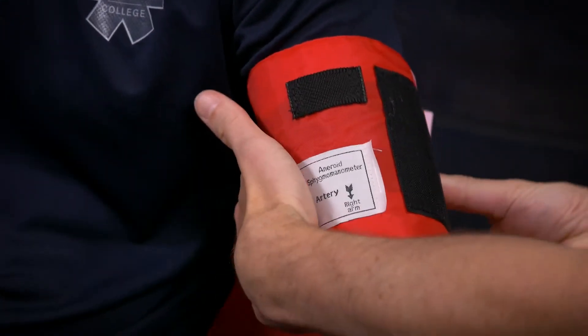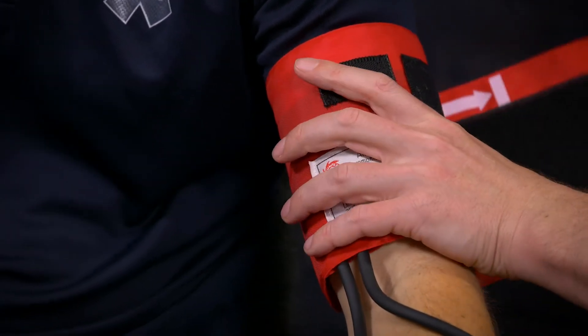So taking a blood pressure now. We'll start by palpation. Ben, do you mind if I take your blood pressure? Sure. I'll just pop your arm right there — I've got a good pulse there. I'm going to pop my cuff on, make sure the artery marker lines up, and make sure we're in range, which we are.